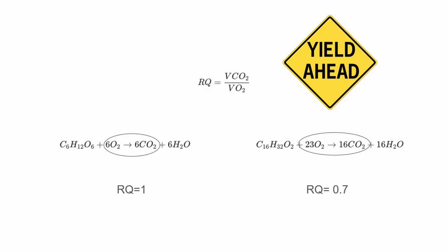Now, this is the respiratory quotient, and this is what we imagine is happening at the cellular level. So during a non-invasive CPET, where we're not drawing any labs, we infer that this is happening by measuring gas exchanges with a face mask, and we call this value the respiratory exchange ratio.